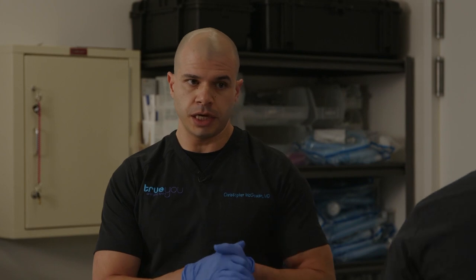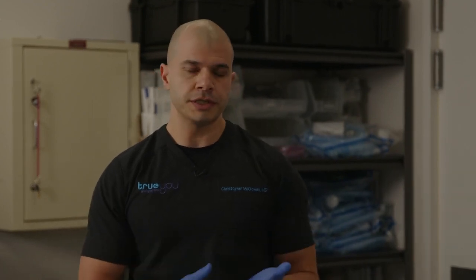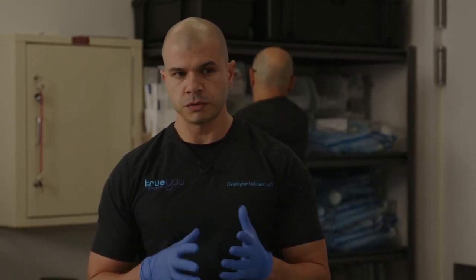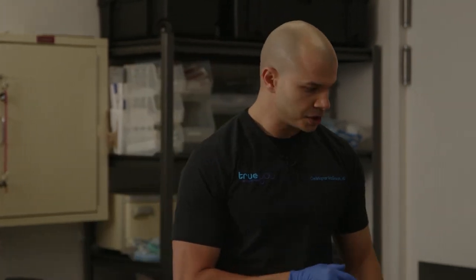If you compare to a surgical revision, which is a common question that we get and something we discuss with all of our patients, a surgical revision is much more complex, often not an option for patients due to the complexity and risk, and does carry a much higher risk and longer recovery. So with this, we're talking about shorter recovery, much lower risk. If you have another question, I'll take that now as well as we're changing scopes.